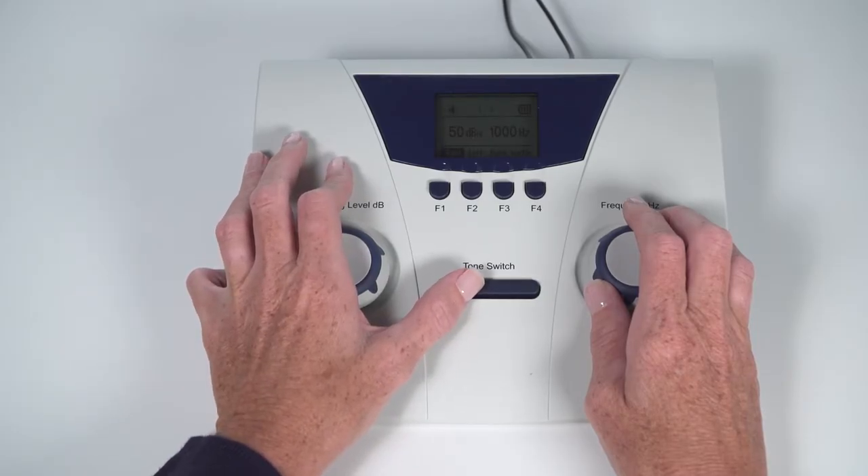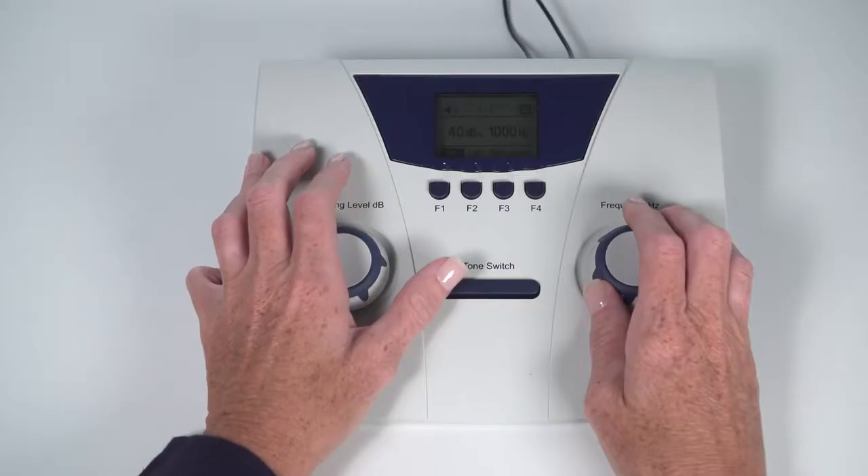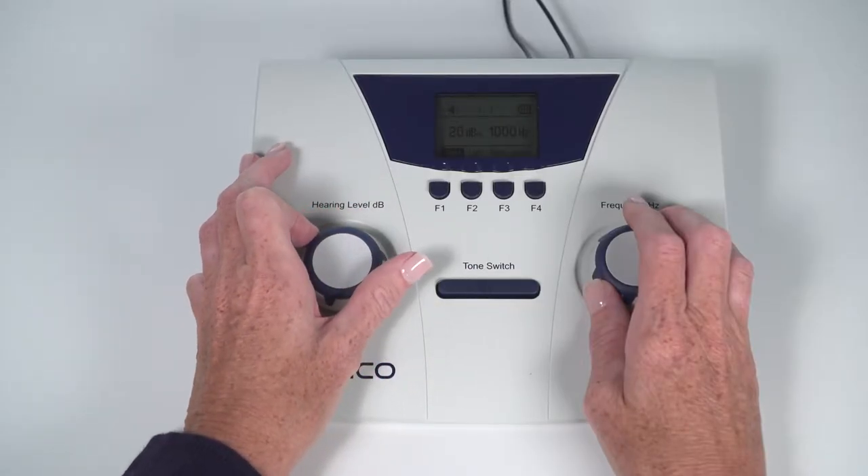Press the tone switch one to two seconds to present the tone. Wait for the child's response to proceed. If no response, re-instruct and present again. If still no response, switch to the other ear and present. When the child responds, lower the volume level to the screening level.